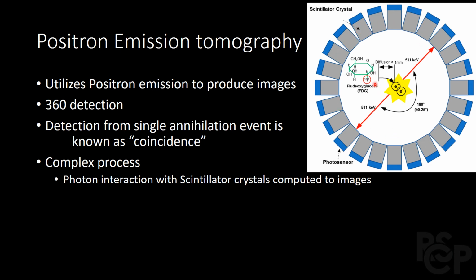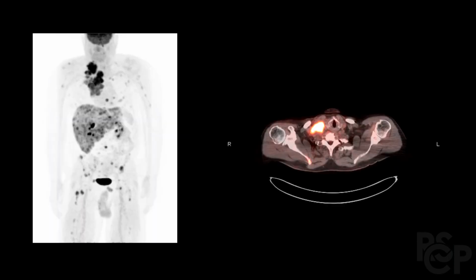And this is a very complex process. It involves a lot of algorithms and timing, and the photon interaction with scintillator crystals is eventually what is used to compute the image that we see in PET scans.